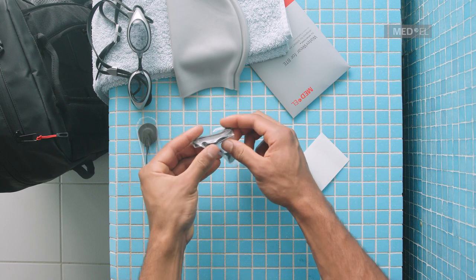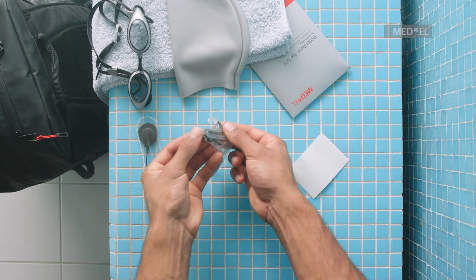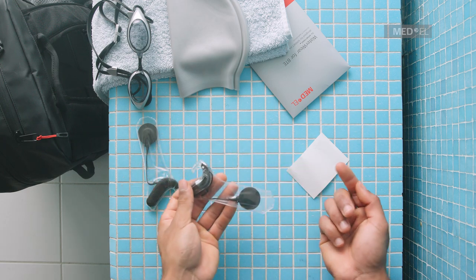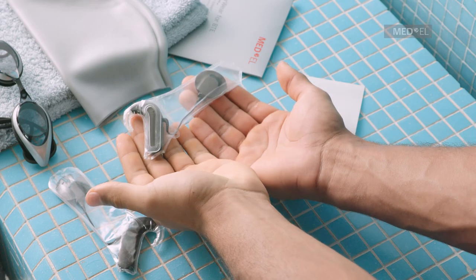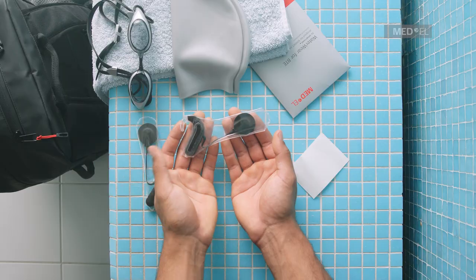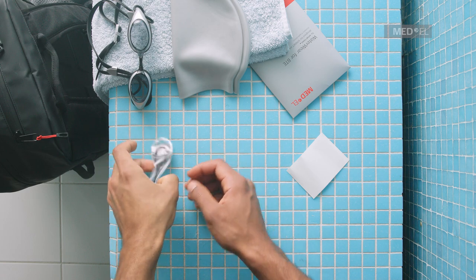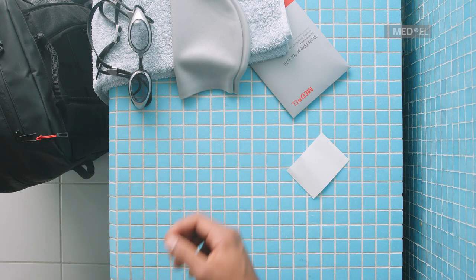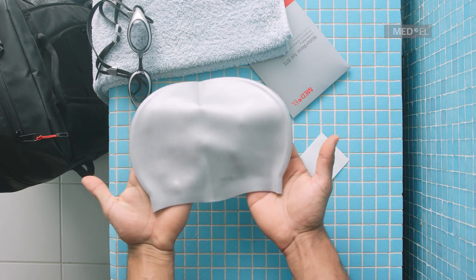Check again that the audio processor is sealed on all sides and that there are no wrinkles or bubbles. Each adhesive strip can be used only once, but each Waterwear cover can be used up to 20 times. We recommend using an additional fixation device during swimming, such as a swimming cap.